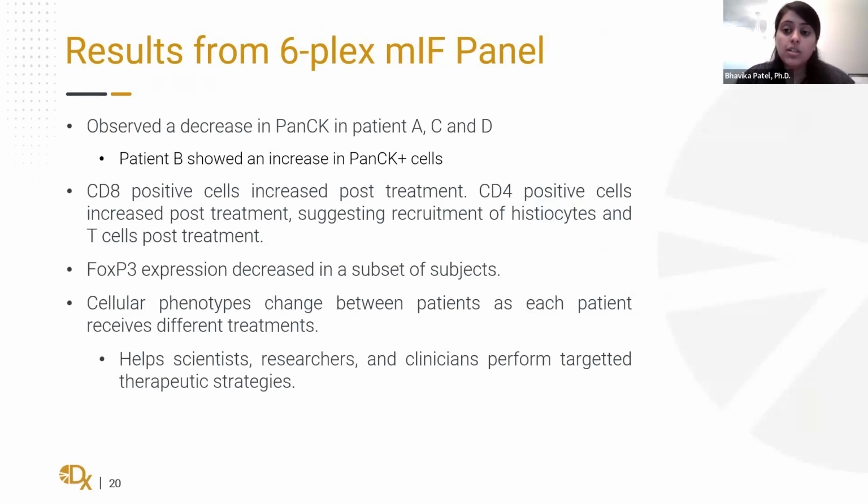We observed a decrease in PAN-CK in patients A, C, and D. Patient B showed an increase in PAN-CK positive cells. However, we can't make any conclusions based off of this just due to the sample size. In order to make any definitive conclusions, we would want to repeat these findings using additional biopsies.